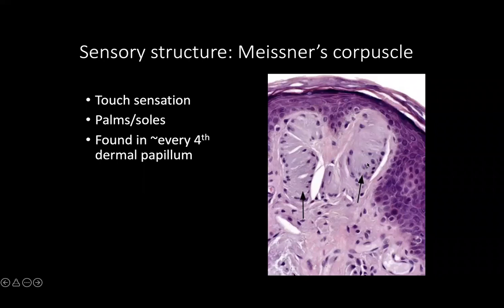And it looks almost like these vertically oriented potatoes or something, or little cocoons sitting underneath the skin there. In dermatopathology, people often hallucinate that things look like everyday objects. So you can create your own analogy of what this looks like to you, and please let me know. I find it fun.